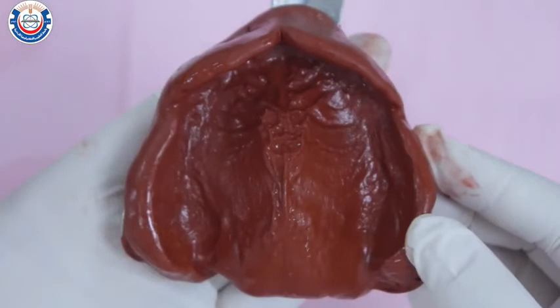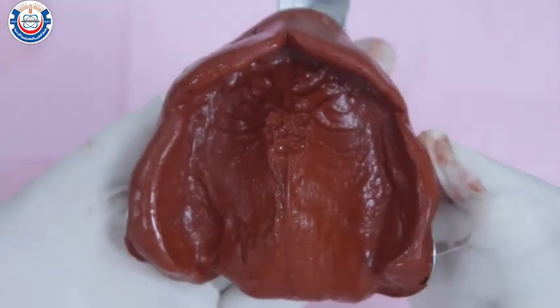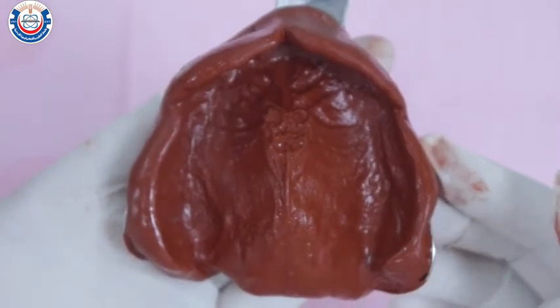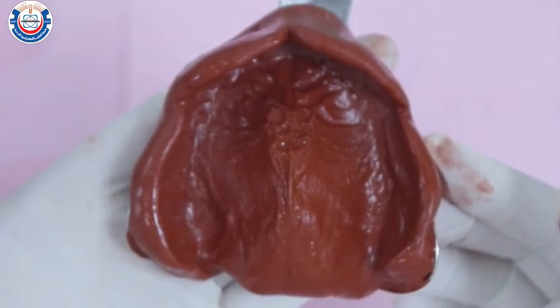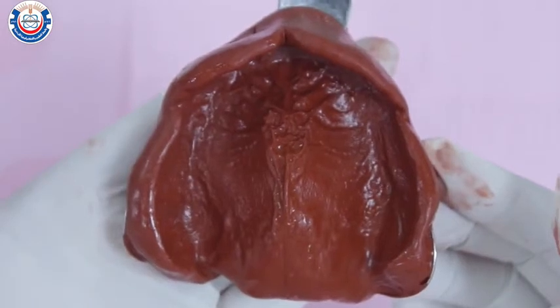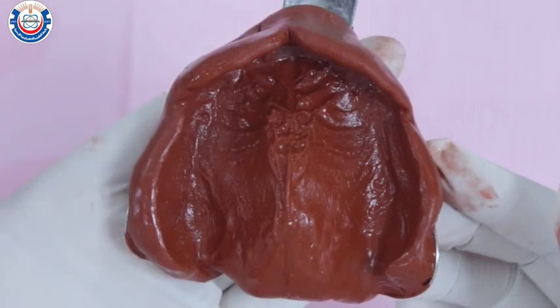Wash and dry the impression and inspect it under a good light source. Make sure all anatomic landmarks are visible: the full depth of the labial and buccal sulcus, the disto-buccal sulcus, the maxillary tuberosities, the buccal and labial frenum, and that the residual ridge is centered in the impression material.